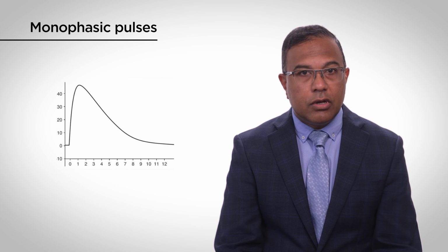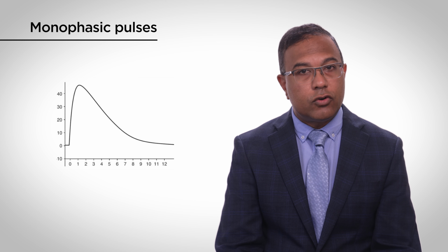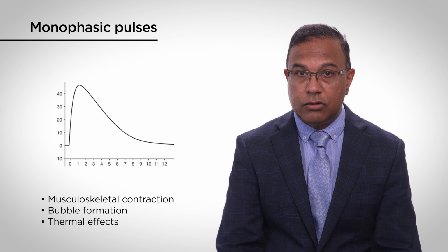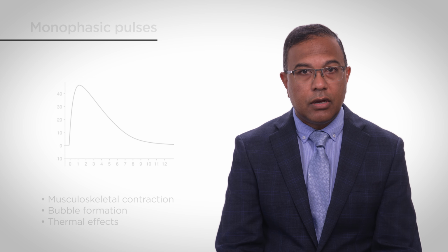In general, monophasic pulses are actually very efficient at killing cells. Unfortunately, they also cause a lot of musculoskeletal contraction, bubble formation, and thermal effects.